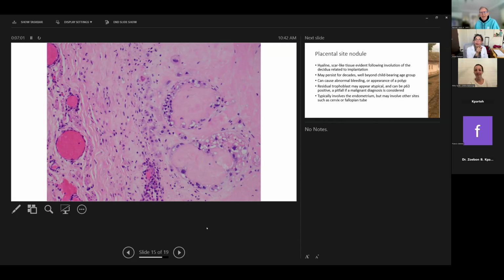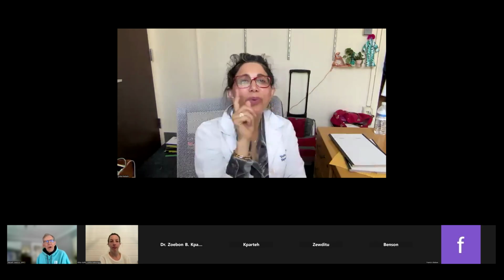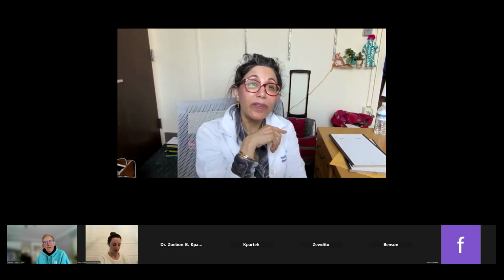Lewis, I have a question. When was her most recent pregnancy? She was immediately postpartum and was having this salpingectomy within the week of delivery. Elsewhere on the tube there was a little bit of true stromal decidual type change on the serosa. Huh, interesting. And had she had an ectopic previously?